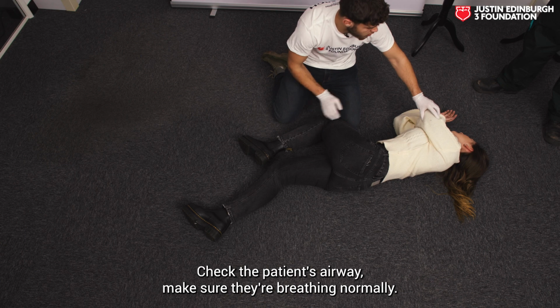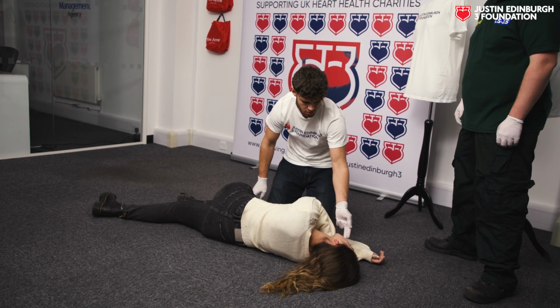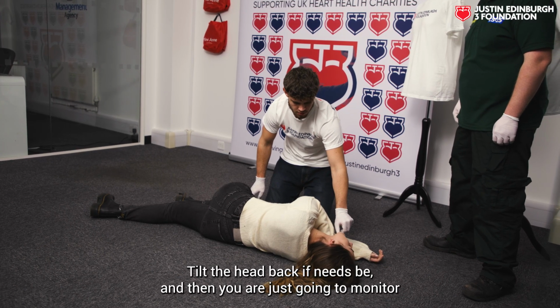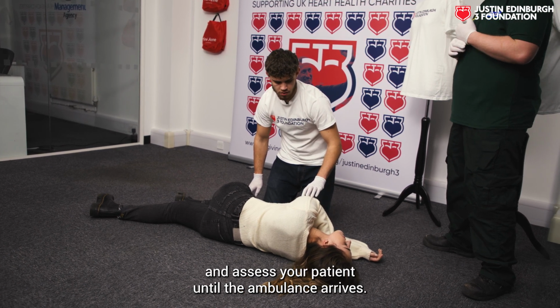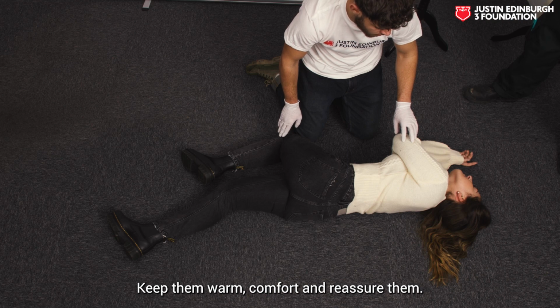Check the patient's airway, make sure they're breathing normally. Tilt the head back if needs be. And then you're just going to monitor and assess your patient until the ambulance arrives. Keep them warm, comfort and reassure them.